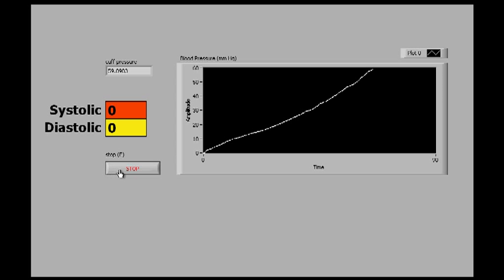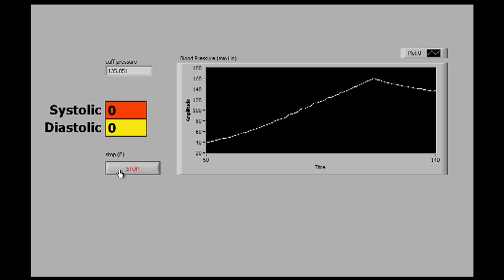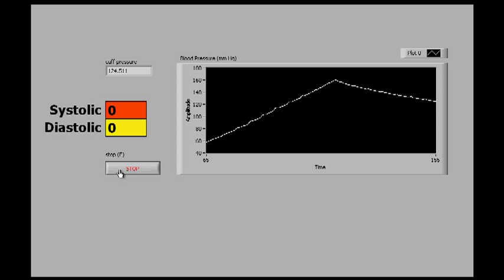When the VI starts, the pump is activated to inflate the cuff, and the solenoid valve is held closed. At a pressure of 160 millimeters of mercury, the pump is stopped and the pressure slowly comes down through the bleed valve.